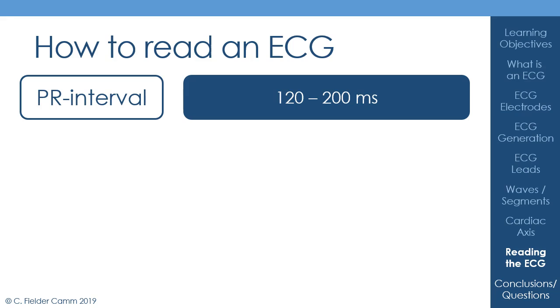And we don't use the PR segment primarily because although that represents time that the signal is just in the AV node, you can imagine that the signal may get to the AV node while the depolarization of the atria is continuing. And if you had a big left atria causing a wide P wave, that may make the PR segment look shorter, even though there's been no change to the AV node.